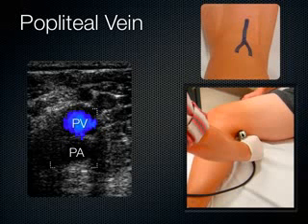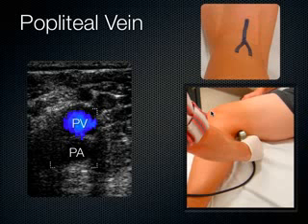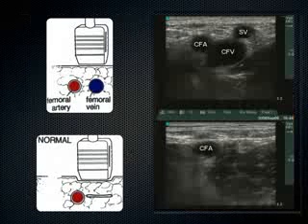Now, when you do the scan, what I do is I hold the probe in one hand, and then I put my other hand on the patient's knee, and I use that as sort of counterbalance or countertraction to push those two things together. Now, on our models here today, you may forget to do that. Their legs are pretty small, but on the range of body habitus that we encounter clinically in the emergency department, you're going to really want to get in there and use both your hands counterbalancing each other. So try to remember to do that today when you're practicing this test.